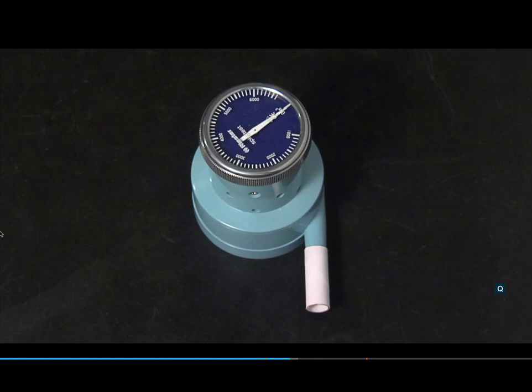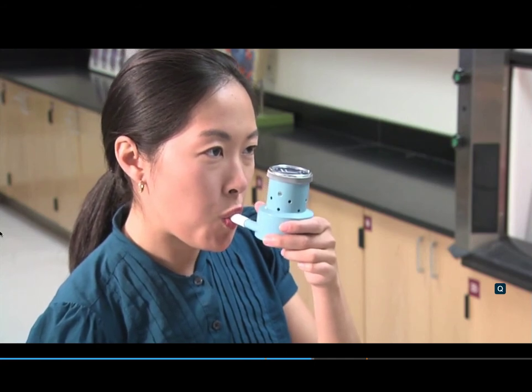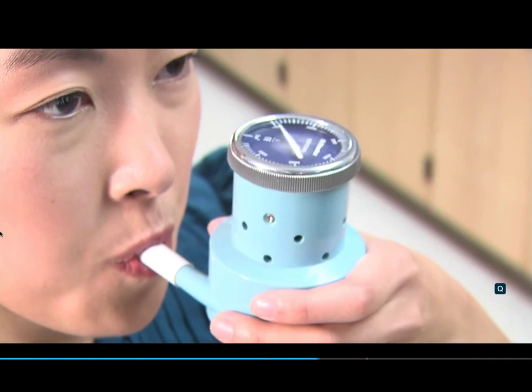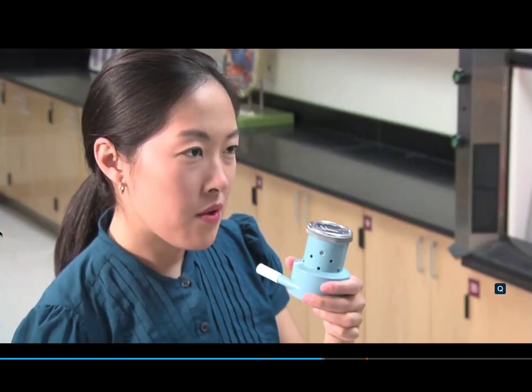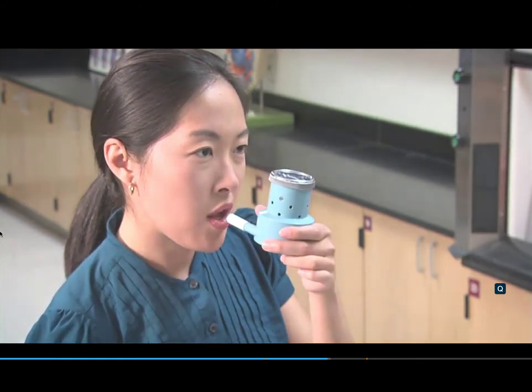Most of our breathing is done under resting conditions, so let's return to tidal volume. We will be using a non-recording spirometer to demonstrate measuring volumes and capacities. To measure a tidal volume, the subject will inhale a normal breath and then exhale into the spirometer. The spirometer can measure only exhaled volumes and capacities. Subjects should not inhale using the apparatus. It's always best to take several readings and calculate an average volume.